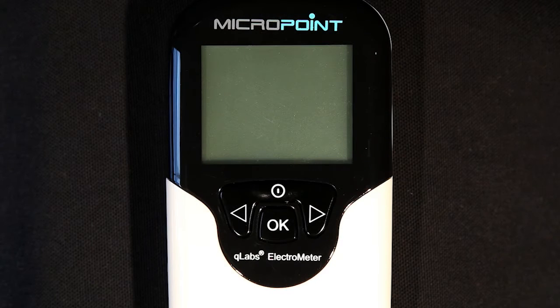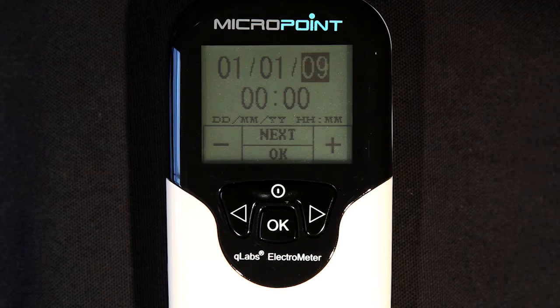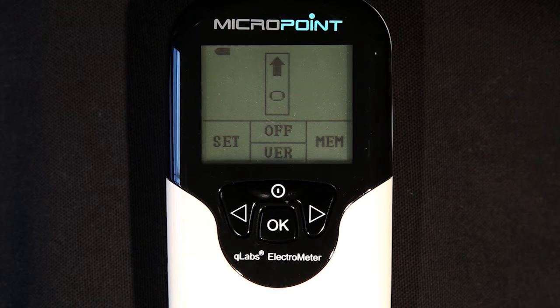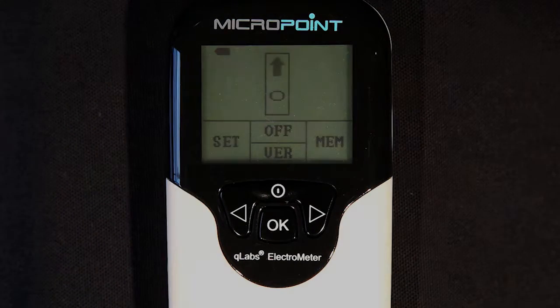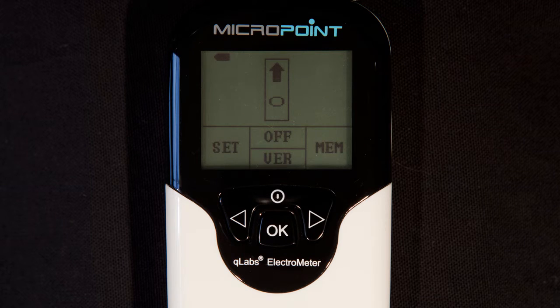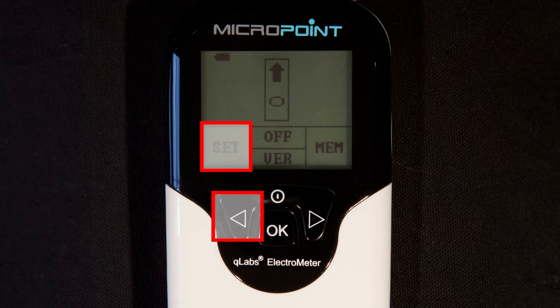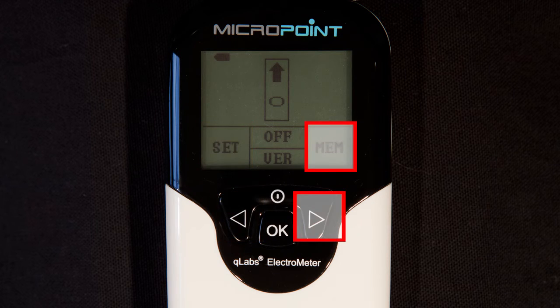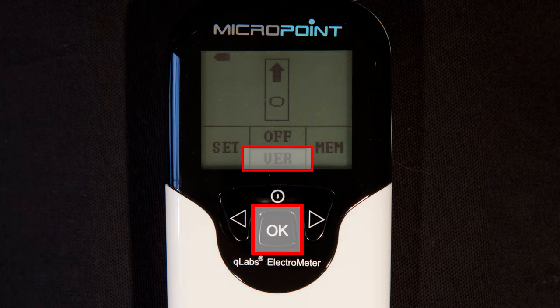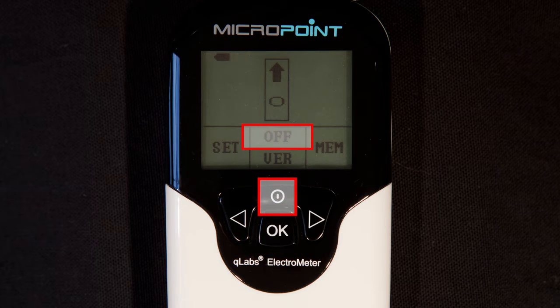When the Q-Labs Electrometer is initially powered on, it will beep and automatically enter the setup mode. In the setup mode, you can change the Q-Labs Electrometer settings, or press the OK button to bypass the setup menu to reach the home screen. You will notice a grid on the lower portion of the LCD screen that indicates which buttons coincide with functions that will change as you walk through the interface. For example, on this screen, the left arrow will enter the settings menu, the right arrow will recall stored test results in memory, the OK button will display the firmware version, and the power button will turn off the Electrometer.